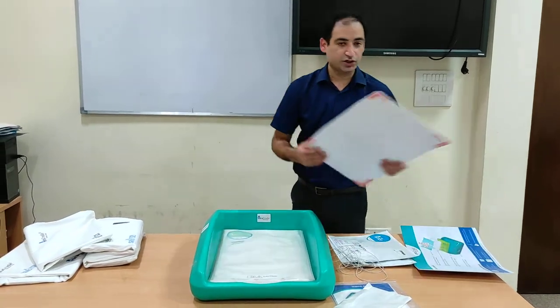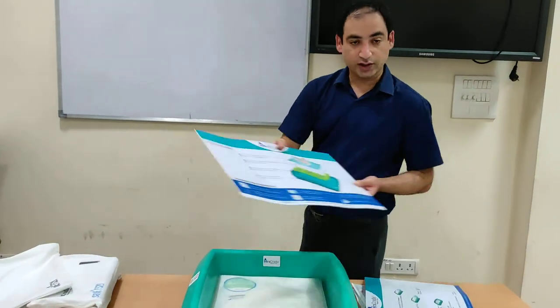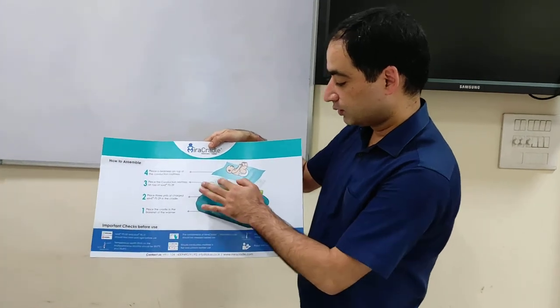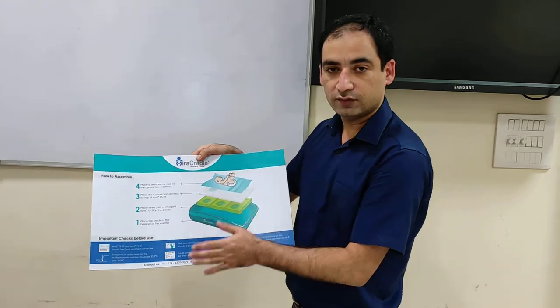In summary, there are four layers: the first layer is the cradle, the second layer is the FS29 — three sets — then we have the mattress, and then the baby sheet. These are the four layers of this setup.